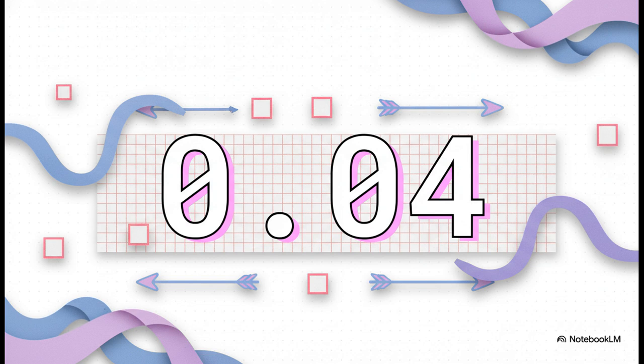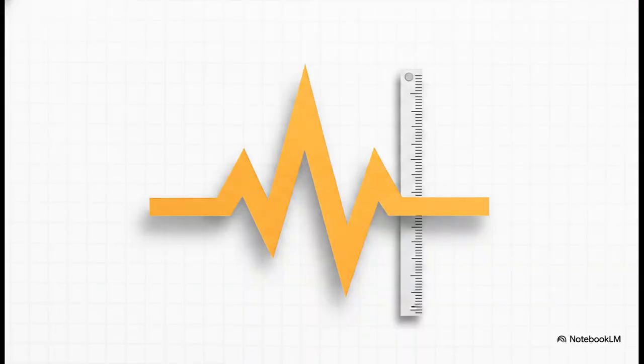Look at the absolute smallest box on that grid. That single, tiny, millimeter-wide box represents exactly 0.04 seconds. Everything we measure regarding how long it takes an electrical impulse to move through the heart relies entirely on counting those little 0.04-second increments. The second rule of our grid is voltage, and that runs vertically. We measure the electrical amplitude, or the sheer power of the heart's signals, by looking at how high or deep those lines go. The standard calibration is that 1 millivolt of electrical energy equals a 10 millimeter high peak on the paper. So, horizontal is time, vertical is voltage. Boom. Now we have our foundation.